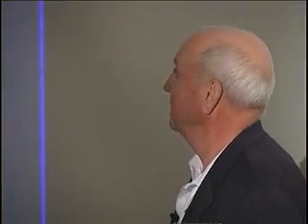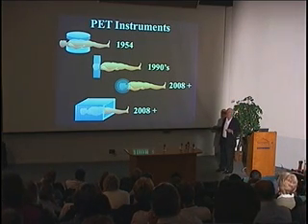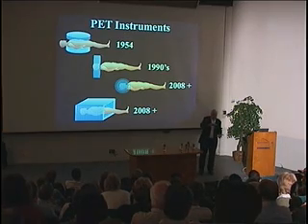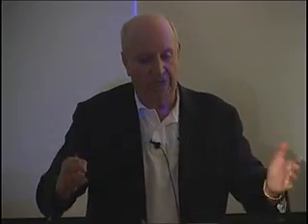Okay, so let's move on. So here's the evolution of PET instruments. This is the first one built by Anger in 1954. Baird Whaley was involved in the administration of Donner Lab in those days and was sitting there with all of his money and his purse, etc., tied up in a safe because Hal would be knocking on the door for the next phototube, etc., to build his dual-headed gamma camera. Dual head because if you have these annihilation photons that are coming out like that, you want to get them in time coincidence so you can do a better job in making an image without having to put in place what we know as a collimator.